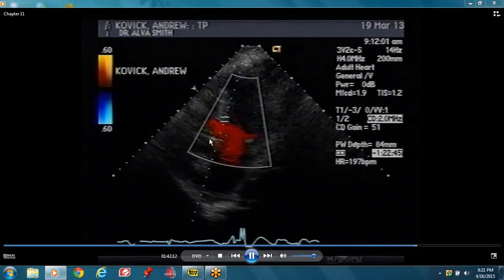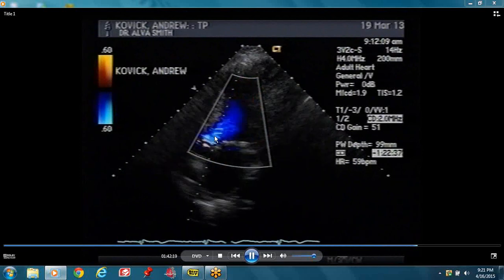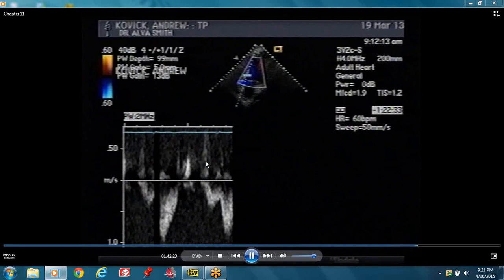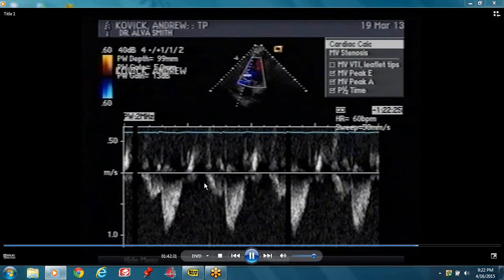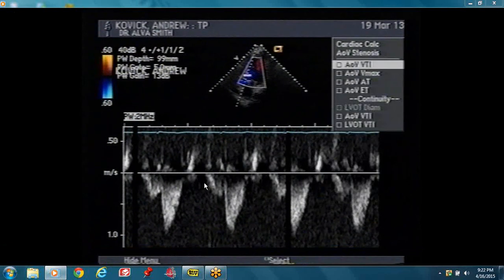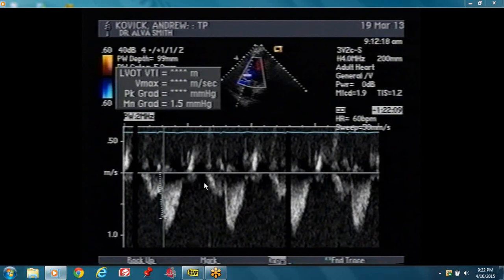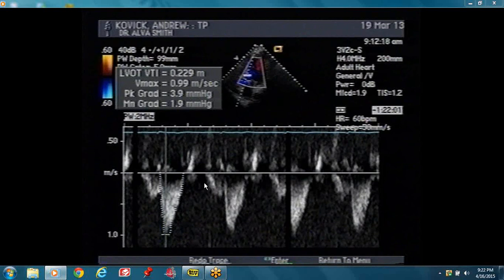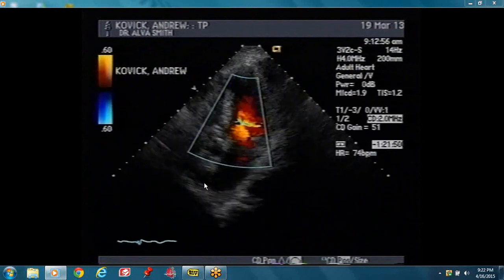You come straight down to the left ventricular outflow track. Remember, this patient has a little aortic stenosis so you don't want to get too close to the valve, because if you are too close to the valve you're going to get some turbulence and falsely increase your LVOT velocity. When you use it in your equation to calculate the valve area, it's going to falsely increase the valve area. You just plane the LVOT signal and it will give you the VTI.